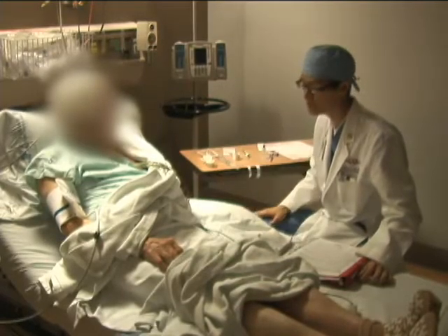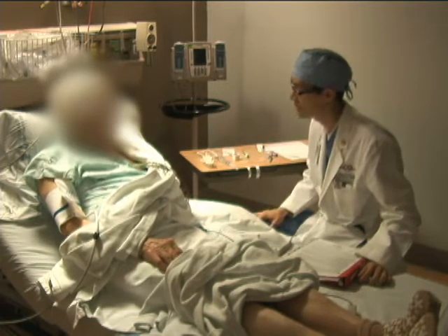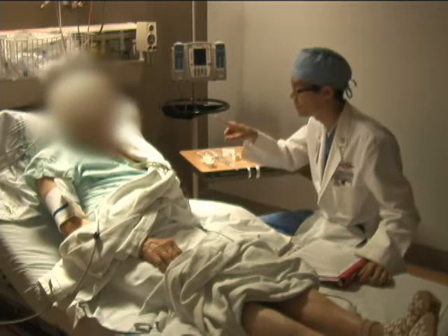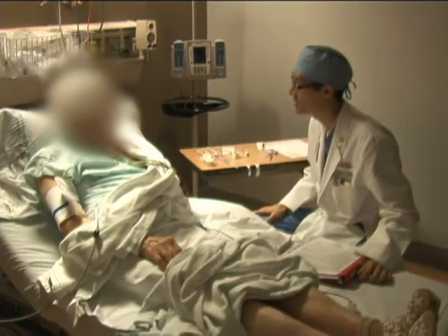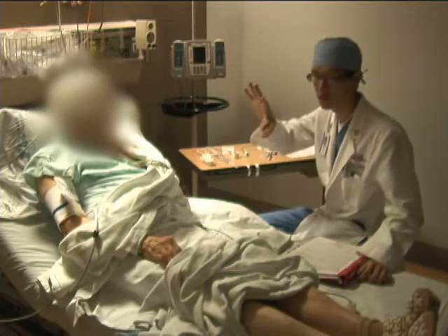Intravascular ultrasound, IVUS, has several clinical indications, including assessing severity and morphology of a coronary artery lesion, determining optimal stent sizing, identifying complications of coronary intervention, and evaluating optimal stent implantation.